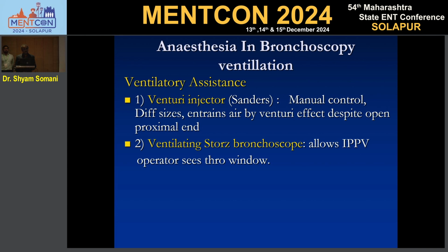If fragments are there, I'm going to ask him, okay boss, if oxygen saturation is good, let me do something. And the line where he should inform me is like 85, 80, 70. At that time he just informs me it is going down, so I can break and allow him to ventilate.